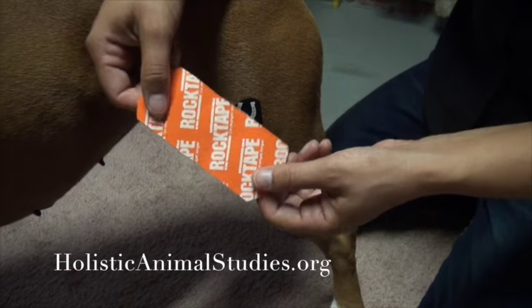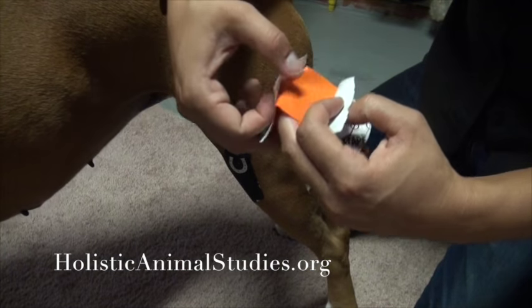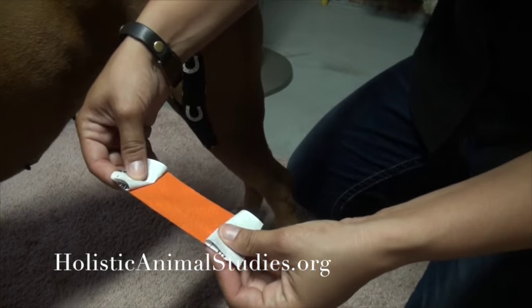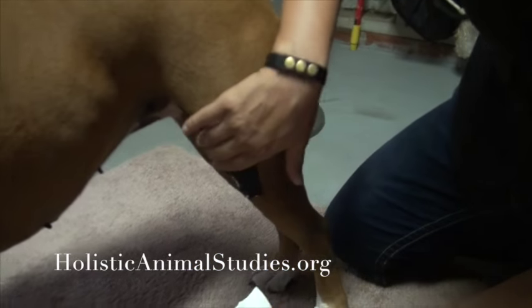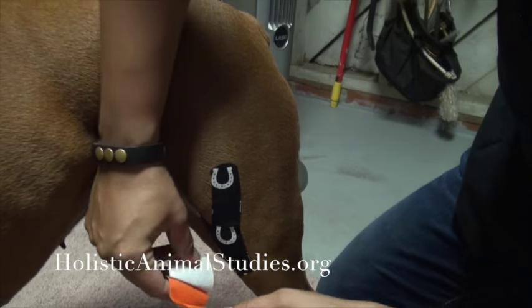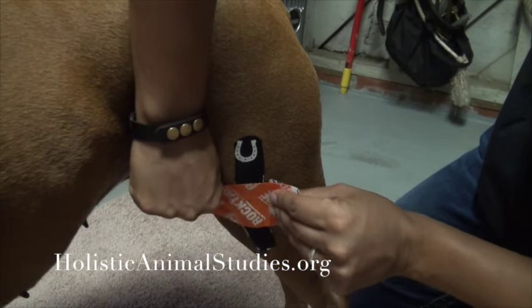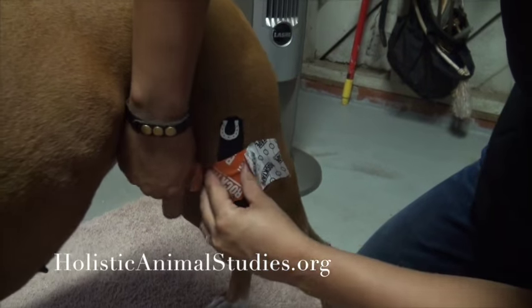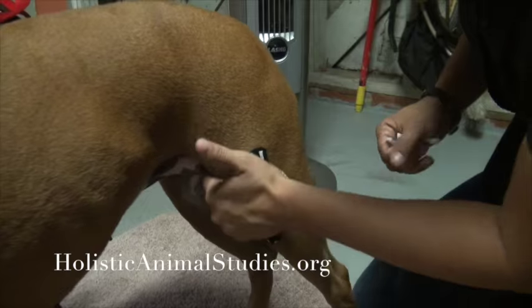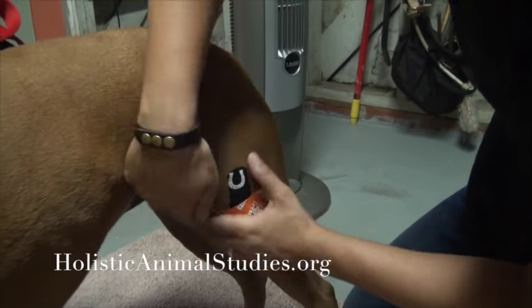So we get the I strip cut. I'm going to rip it in the middle and pull the paper back a bit. We're going to do about 50% stretch because we want to stabilize the joint, so we're going to go right over the area where the patella would be at 50% stretch.